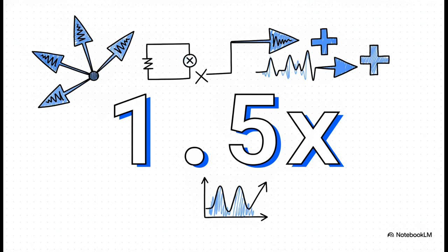Now, there's a key technical modification needed for those unipolar limb leads. See, the native signals they record are actually pretty small, a little too small for easy clinical use. So to make them clearer, the recording system electronically augments them. This is done by disconnecting the specific limb being measured from the central terminal, which mathematically has the effect of boosting the signal amplitude by a factor of 1.5. And that is why we have the A in AVR, AVL, and AVF.